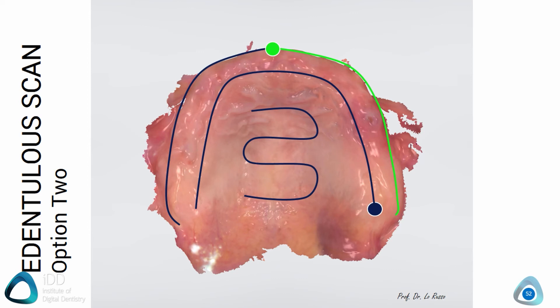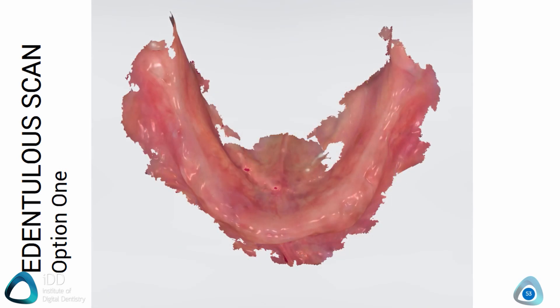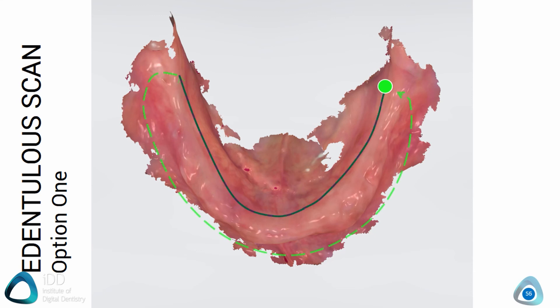Which protocol you use will come down to the operator and simply what works in your hands. With the lower arch, there are obviously no rugae, so we are again limited in the choice for good reference points. The best area to start the scan is the retromolar pad. Starting here, you will likely need an assistant to help retract the tongue, especially in cases with severe bone resorption. Build up the scan by moving the scanner along the alveolar ridge until you reach the retromolar pad on the opposite side, then scan the buccal and labial aspects including the vestibule and the frenum.